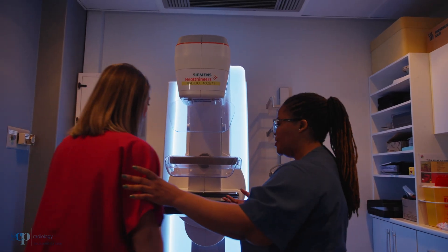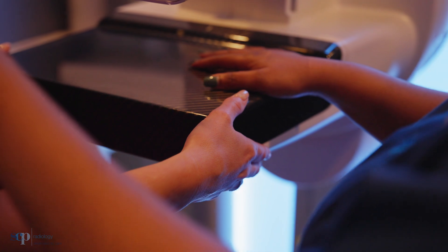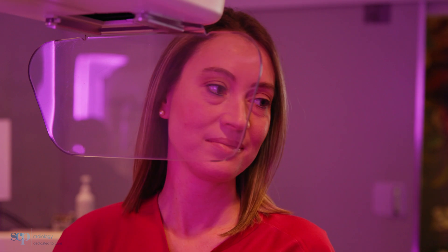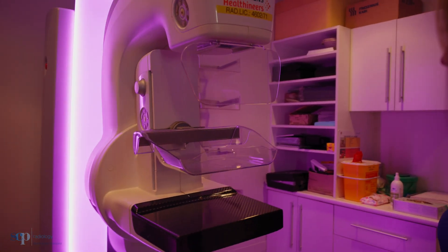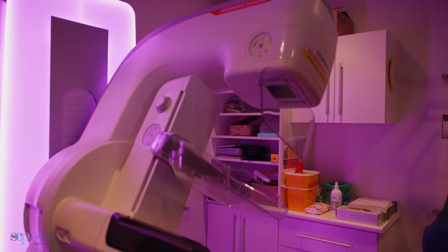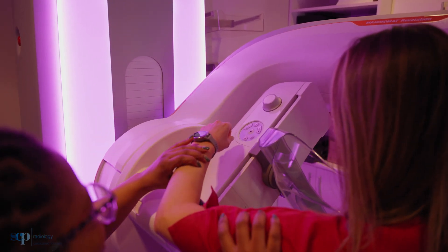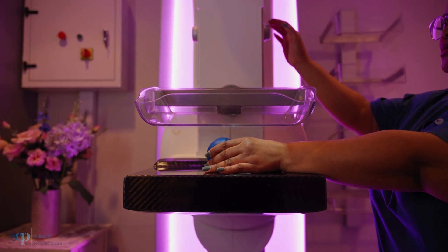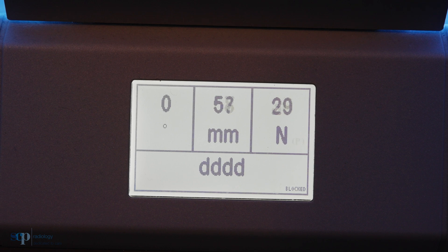I explain and guide them through the examination. I talk to them throughout so that they feel comfortable. I let them touch and feel the machine so that they know what's going to be happening. I explain the different components of the machine — this is where the breast will be positioned, this is the compression. What is the compression used for? And I will not be compressing until you can't breathe — we compress just enough so that we can see what we need to see on the breast.